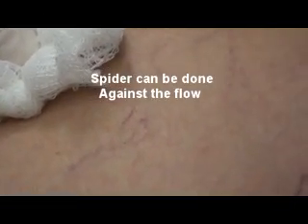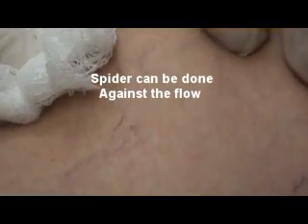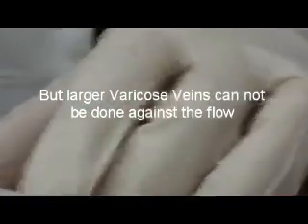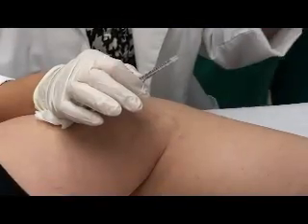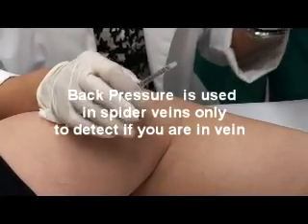So you're going actually against flow, but flow doesn't matter for those — because it's the little ones. The little ones doesn't matter. If you can go against flow, okay. And you put this like a mosquito one. So that the back pressure is going to pull it.